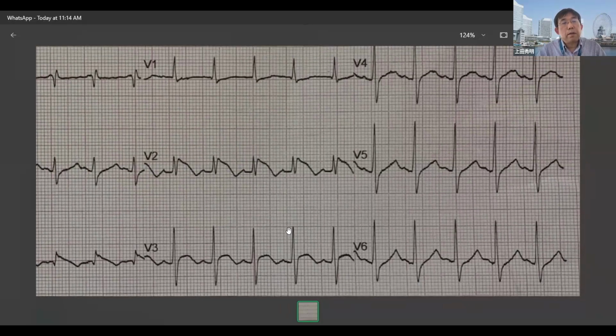I don't know exactly how aplastic anemia cases would show on the ECG, but due to these findings, I feel the contractions may be very severely diminished or not.